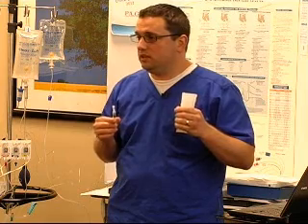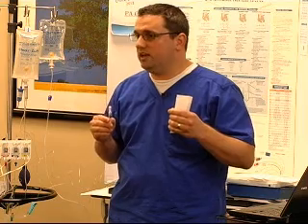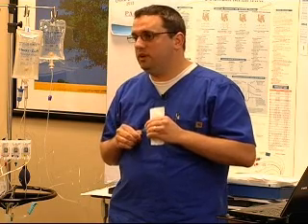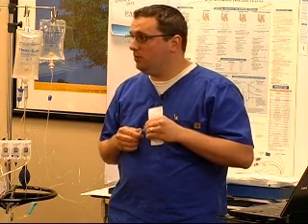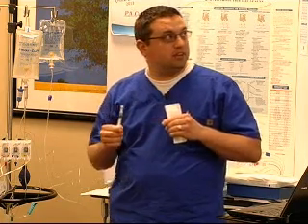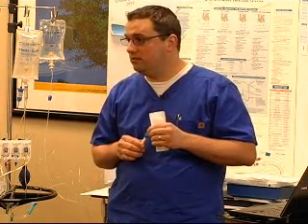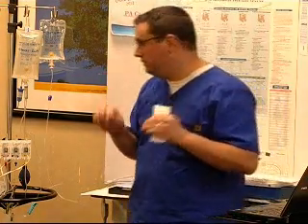Okay, so that's within normal range normally for what we would accept. But you've got to take into consideration, you've got to take off about that 7 or 8%, because that's not really a true reflection of what your SVO2 would be. Okay, so if you get that back, you could think, well, they're actually a little bit lower than what we actually thought or that number would be. Okay, if you're doing a mixed venous sampling of the distal PA, a true SVO2, then you're going to be able to go off this normal value. Okay, so that's the difference between the two, and sometimes that gets a little bit confused, but hopefully we'll clear that up.